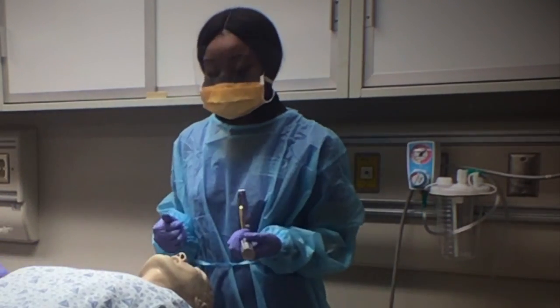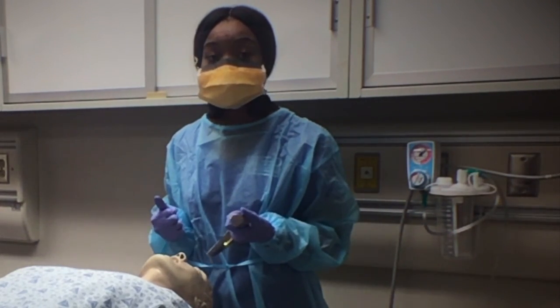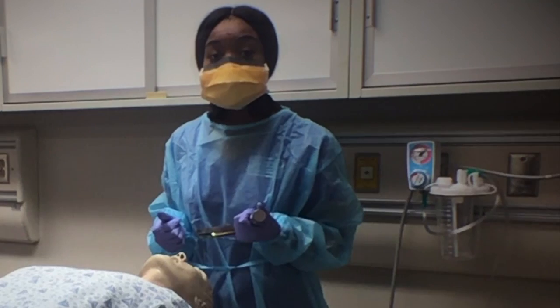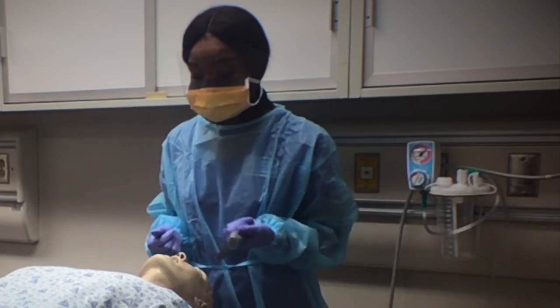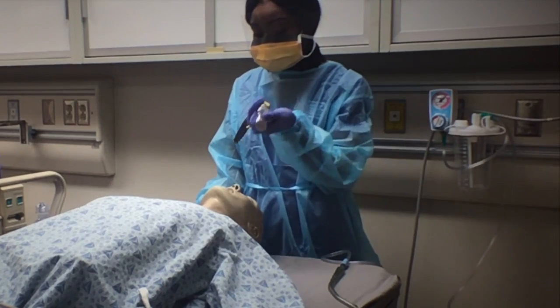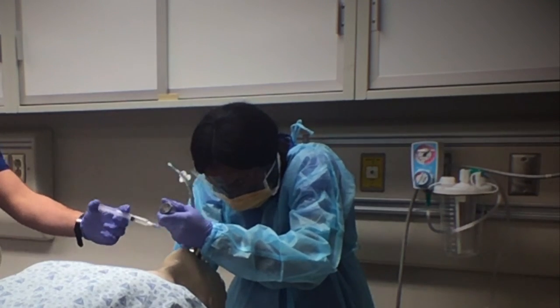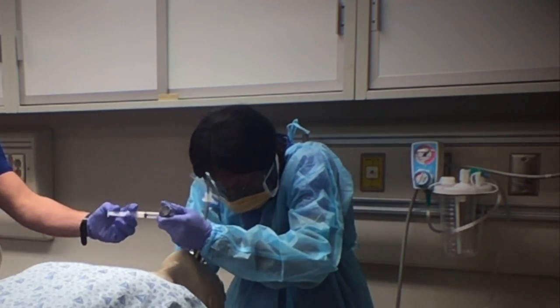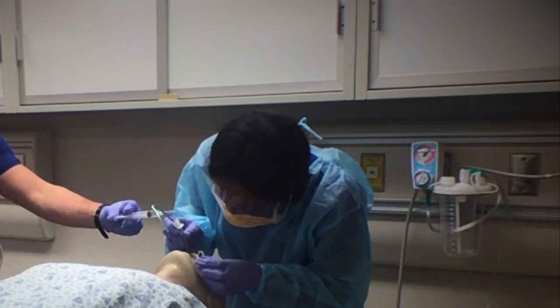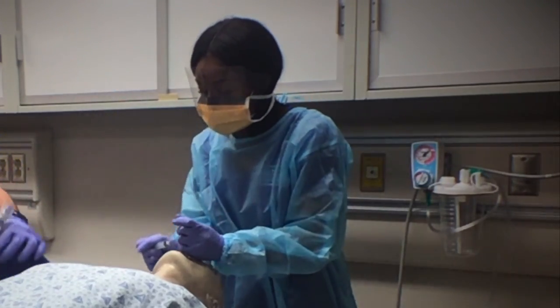I'm going to sweep the tongue out of the way and indirectly displace the epiglottis, and I'm going to advance it to the vallecula, and I'm going to look for the vocal cords. I have 30 seconds to attempt intubation. You have to hold your blade in your left hand. I'm now going to inflate the cuff.